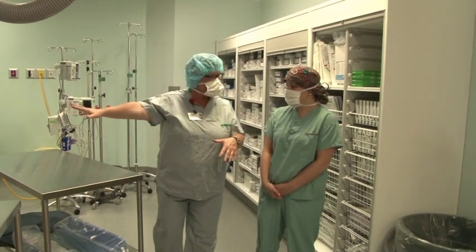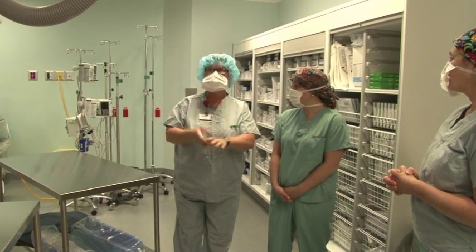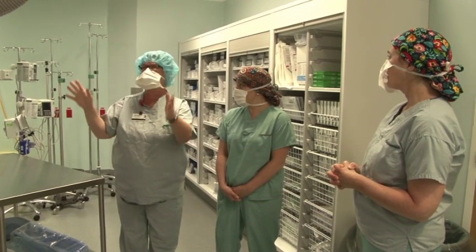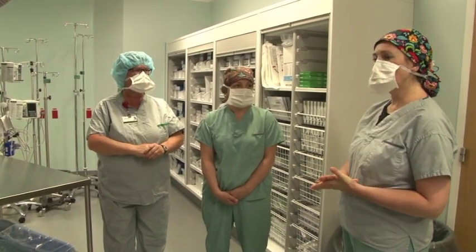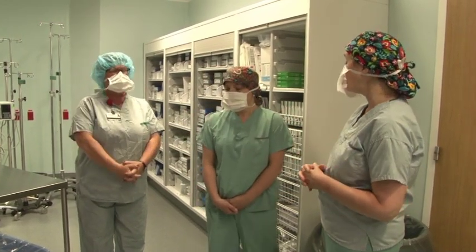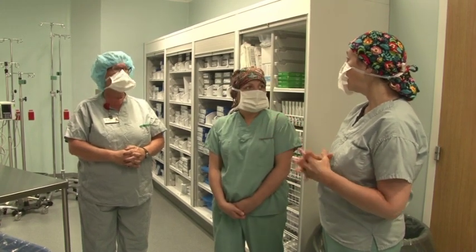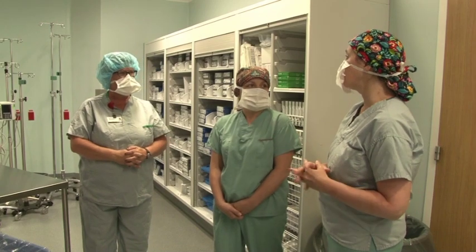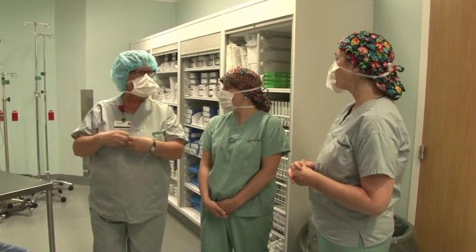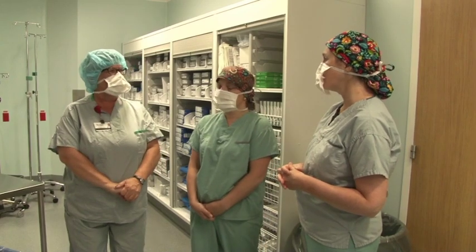So we're managing the patient, the physician is putting the device in or doing the temporary pacemaker, and the diagnostic imaging technician, she'll look after the fluoro. She'll make sure you've got your lead on, she'll help the physician with angling to make sure he's getting the specific pictures that he wants, make sure that he's seeing clearly. Sometimes we have to magnify, and she will do the communication with the physician and they'll take care of that. Oh, wonderful. So the patient is still our responsibility, it's just in a different location, so we can manage that, right? Yes, absolutely. No trouble.